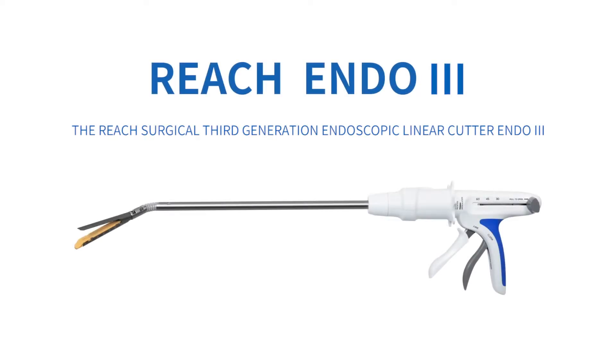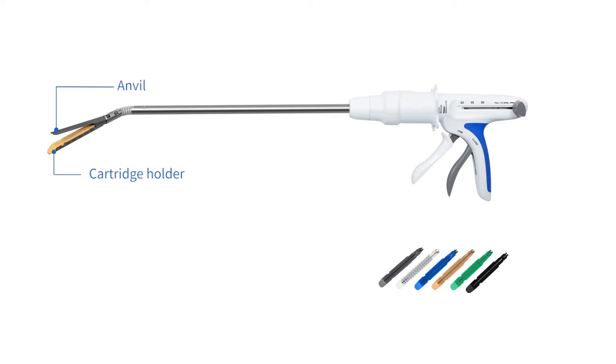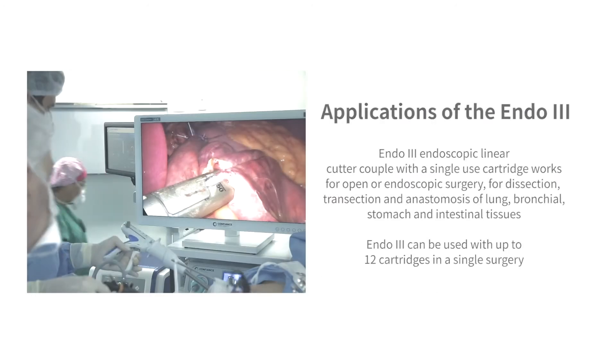The Reach Surgical third-generation endoscopic linear cutter, Endo 3. Introduction to Endo 3 and each of its parts: anvil, cartridge holder, flexible neck, shaft, function knob, rotation, articulation indicator, white trigger, closing lever, return knob, and six different height cartridges.